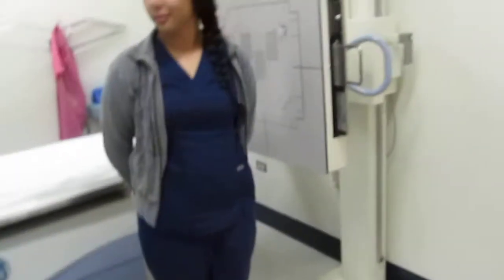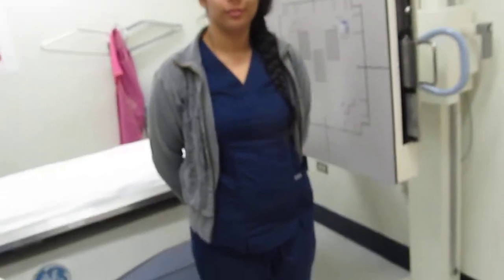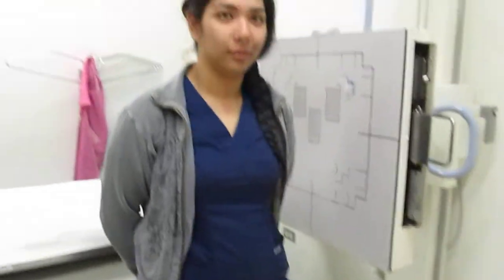So after I reviewed the images, I would come back to my patient who is just patiently waiting, and we got good x-rays today, Jane, so we're all done, and good luck with your procedure. Bye.